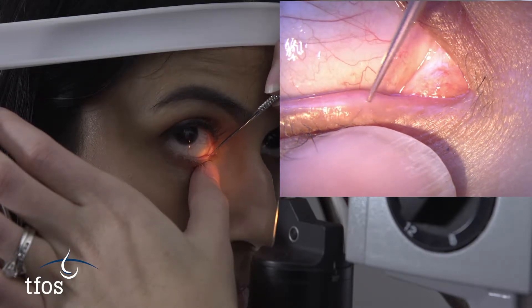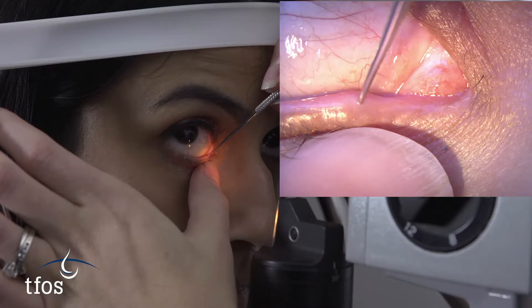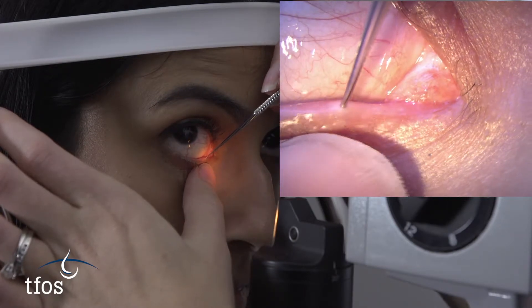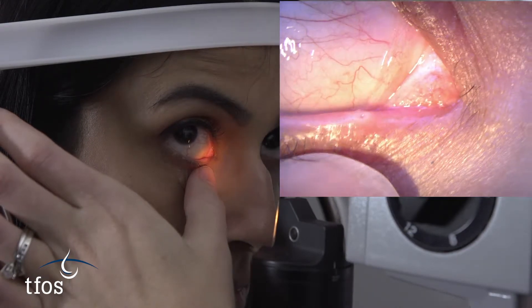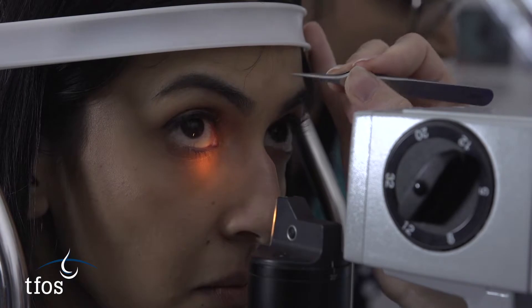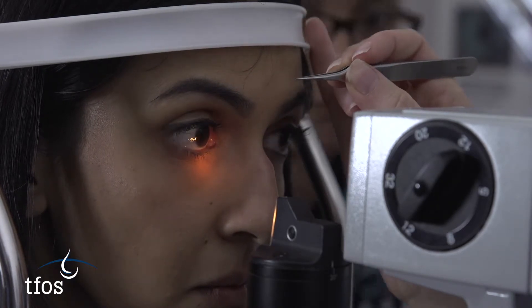The appropriate size of plugs should be chosen according to the patient's punctum size. Prior to inserting plugs, a punctal dilator is used to widen the punctum. Topical anaesthetic can be applied to make the procedure more comfortable for the patient.